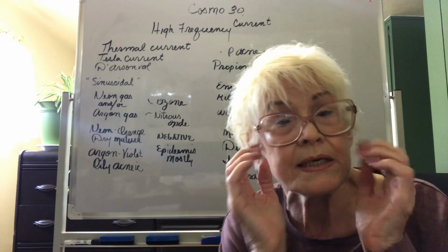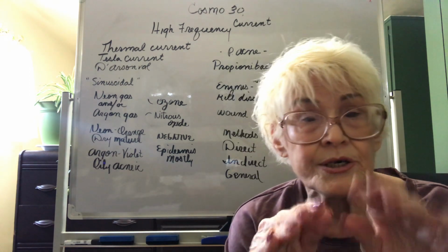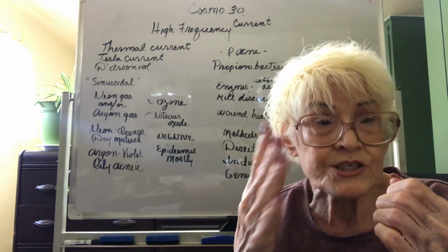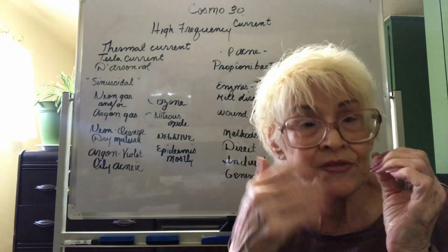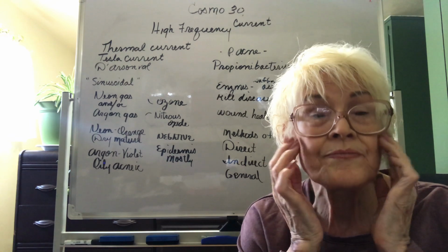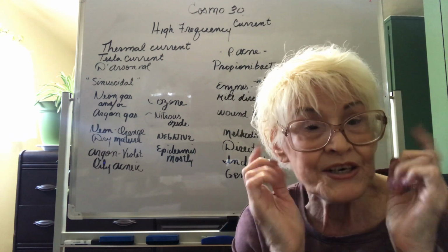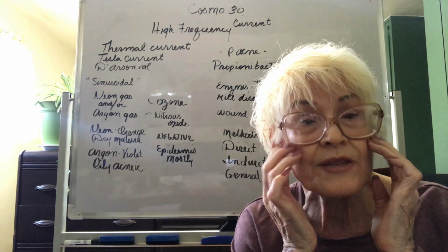Now remember, the skin needs to be damp because water is the conductor of electricity. When you're using electrical modalities, you always have to make sure the client is thoroughly hydrated so that there's enough moisture in the tissues inside the body and externally in the skin that the electricity can flow freely. So I'm doing tapotement on the client's face, and she's gonna feel little pricklies in her skin. And you're gonna feel little pricklies in the end of your fingers. That's how you know it's coming through.